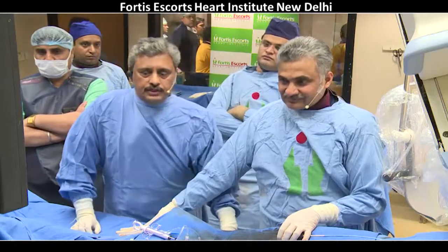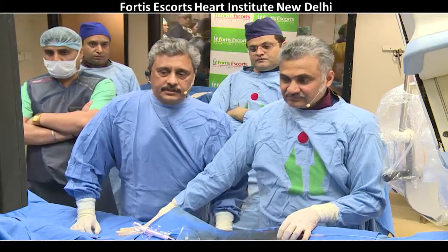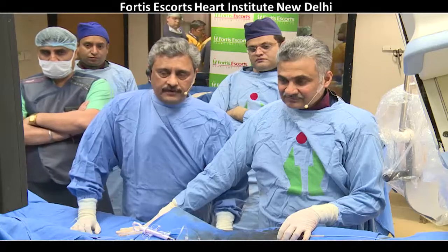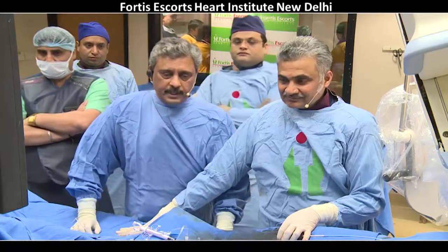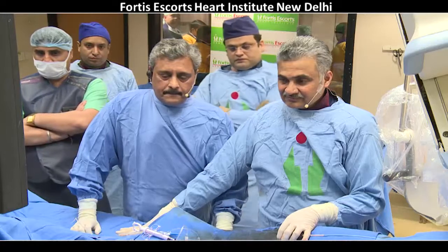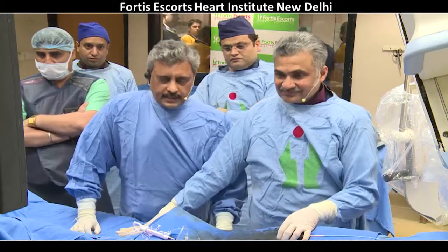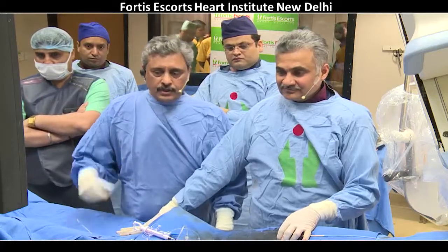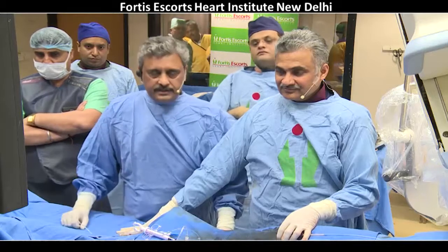So the issues involved in this case were that this is a diabetic patient. There is stenosis, maybe a restenosis, in the proximal edge of the previous stent in the circumflex. And since the balloon was slipping backward and forward, there appears to be a relative amount of fibrosis. Yeah, it's a very fibrotic lesion. So we could also have a discussion with the audience on choices of therapy when you have fibrotic lesions. How do you like to prepare your bed in such cases?